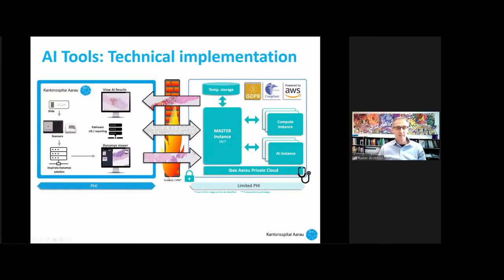So again, bear in mind, I also thought that would be an easy thing to set up. Currently, it's not. What you need is a close interaction with the scanners, the scanning profiles, the resolution, the file export and formats, and the AI tools that have certain requirements for all this.